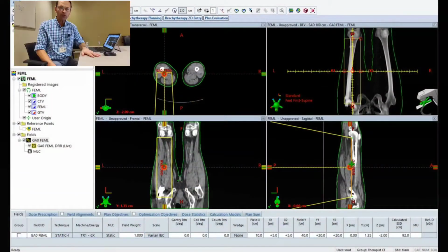So what I'm going to do here is we have a test patient where the plan is to map out an extended treatment to his left femur. We're going to do 120 centimeters SAD. So we'll walk you through what the planning therapist should do to get this ready for the physician.